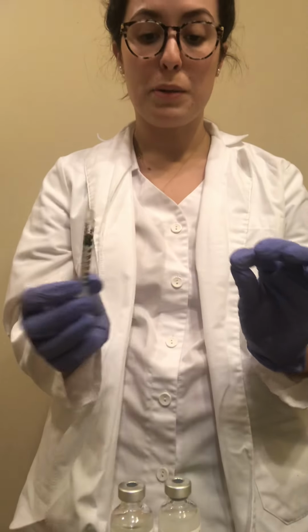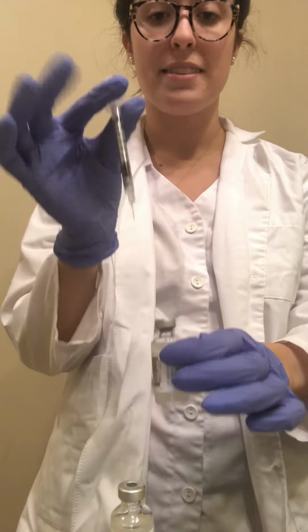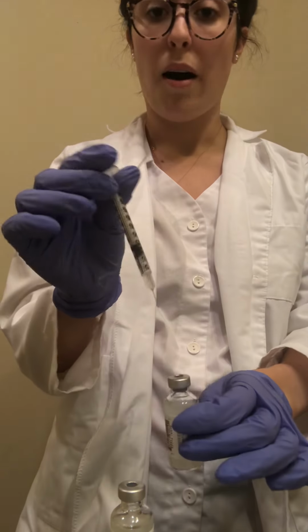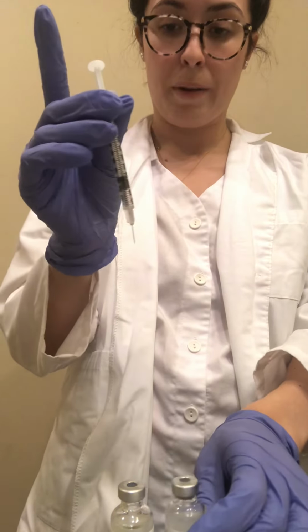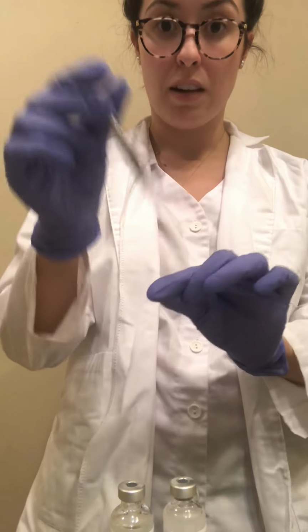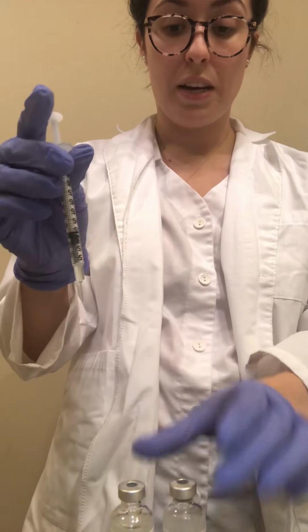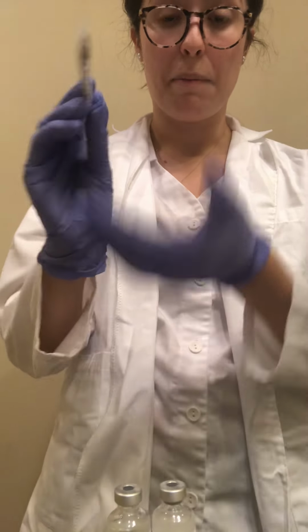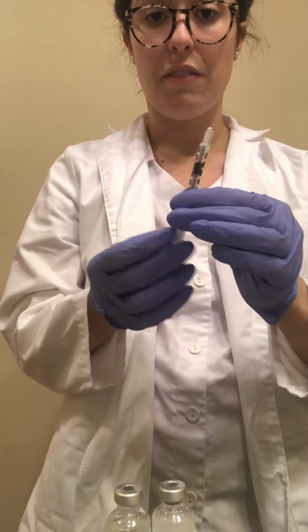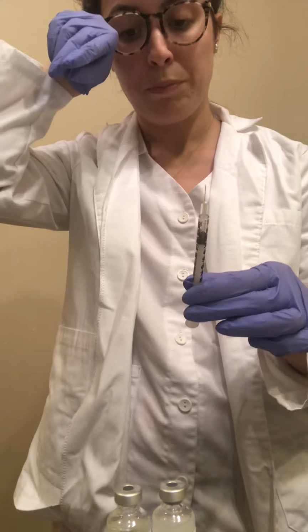And for this purpose, we're going to inject this air into the NPH first because it's going to be the second medication that we draw up. So I'm going to, in order, inject 20 units into the NPH without allowing the tip to touch the liquid solution. And then I'm going to draw another 20 units of air, inject into the regular, flip it up, draw the regular insulin first, then the NPH, and then I'll have 40 units total to administer to the patient.